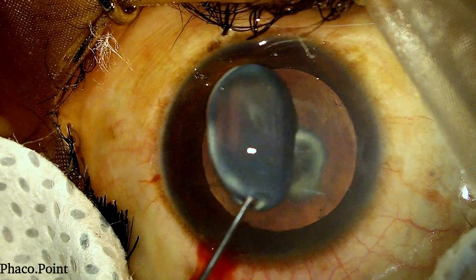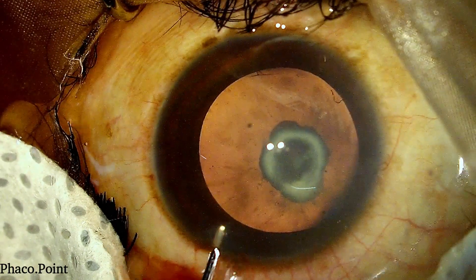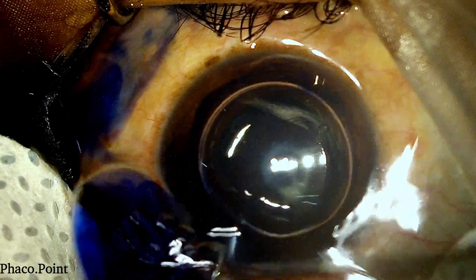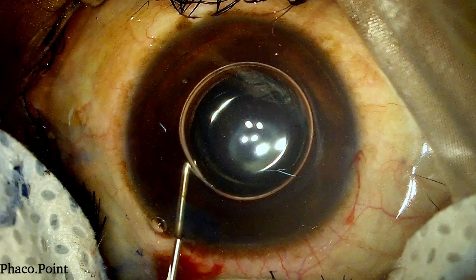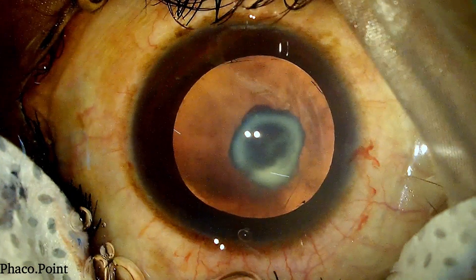Resurfacing the cornea intermittently with viscoelastic helps in preventing the corneal epithelium from drying. This is followed by the introduction of a few drops of blue dye under air to stain the anterior capsule, which is then subsequently washed out. We then proceed with the gentle introduction of an OVD into the anterior chamber whilst displacing the air bubble out of the eye.